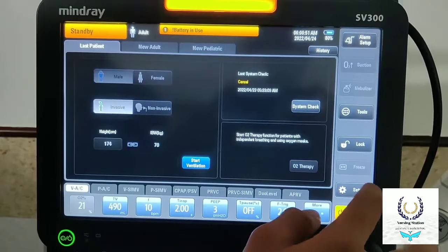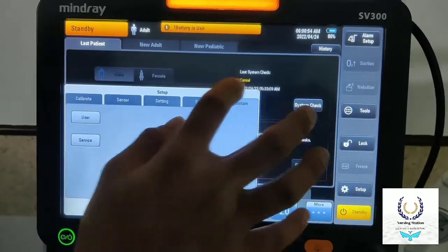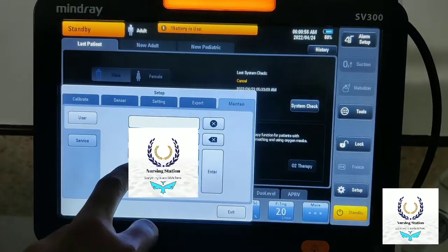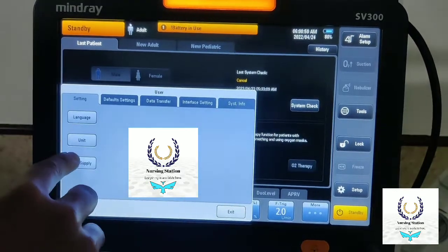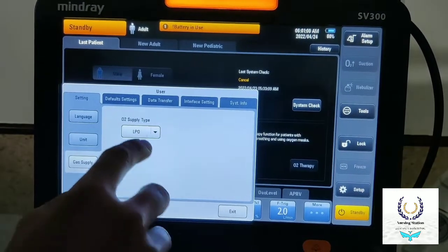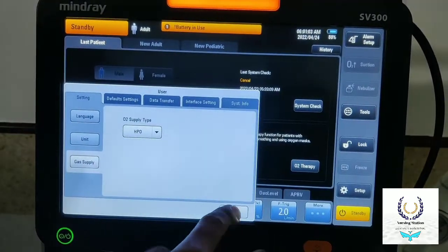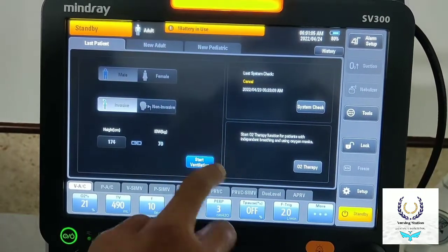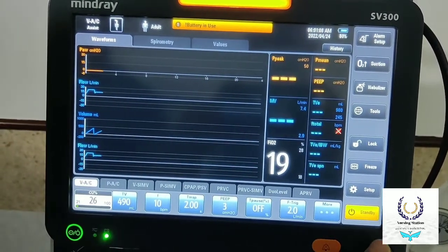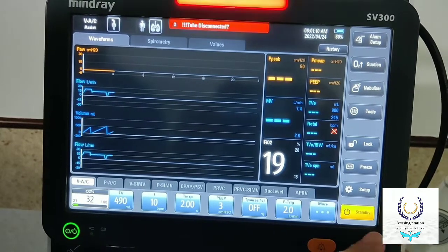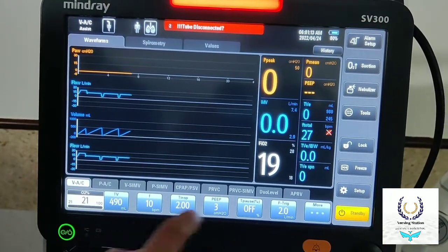Go to Setup, Maintain, User, put the password, then Gas Supply — select HPO — done. Then start ventilation. Now you can see we can manually adjust the FiO2 here, which was not available in LPO mode.